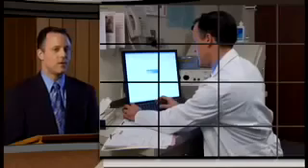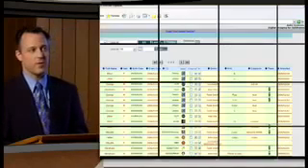And that became a real problem, a real hindrance, especially when you do it not just once, 2, 3, maybe even 4 times a day. So I'd like to show you some of the benefits that we found with the ANCA system within our department. First, we have easy access to patient information.